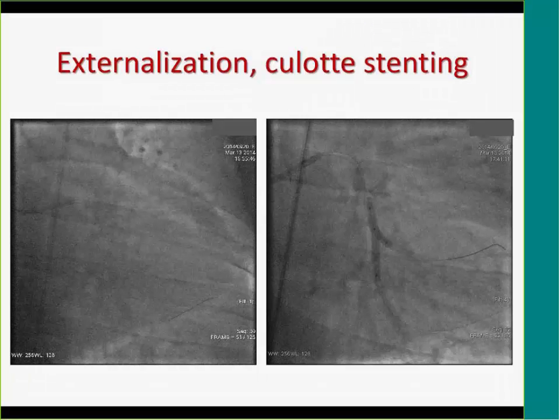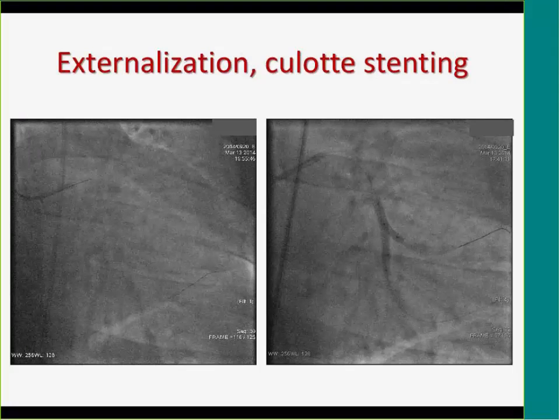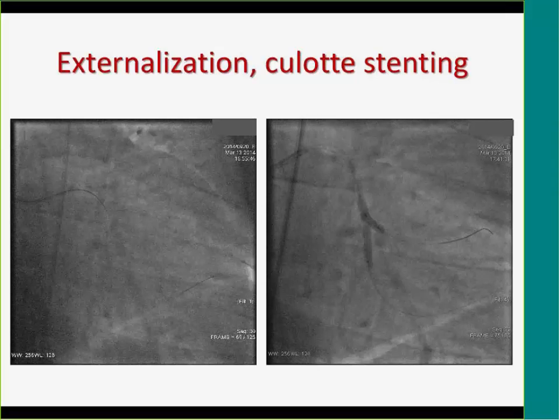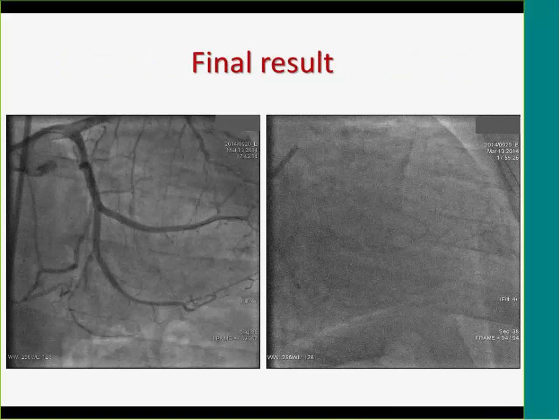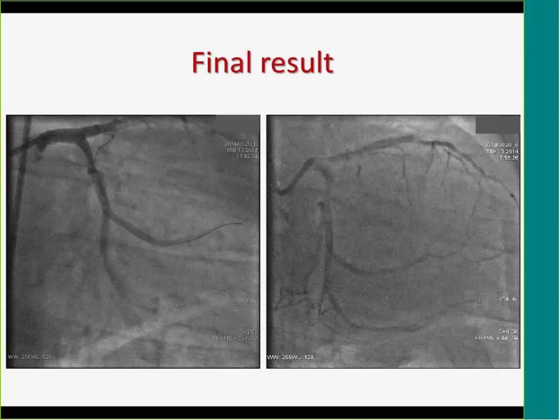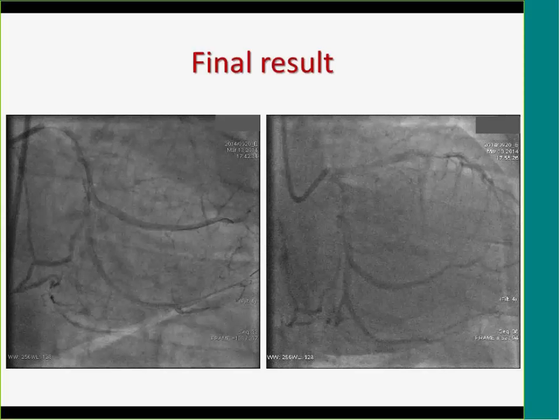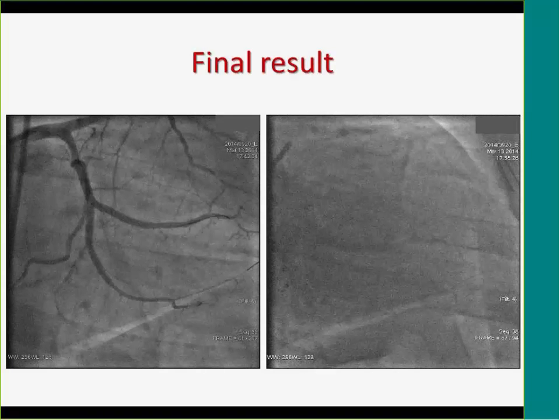After antegrade dilation of the proximal cap and the occlusion, we transformed the previously implanted stent to a culotte stenting, and after high pressure inflation of the culotte stent, we did a kissing balloon inflation, then a POT, and after that we stented the proximal regions of the LAD as well, because although the apex was not viable and we didn't want to open the distal part of the LAD, there were some septal and diagonal branches coming from the LAD.